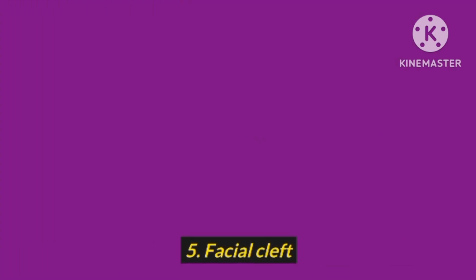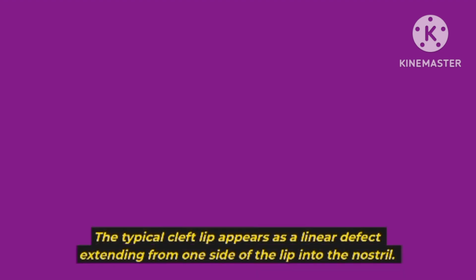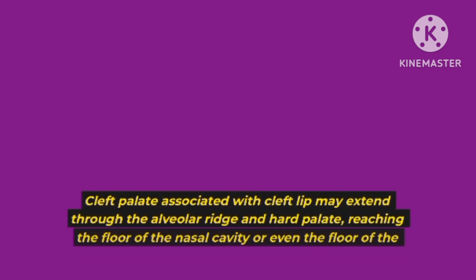Number 5, facial cleft. Ultrasound diagnosis: the typical cleft lip appears as a linear defect extending from one side of the lip into the nostril. Cleft palate associated with cleft lip may extend through the alveolar ridge and hard palate, reaching the floor of the nasal cavity or even the floor of the orbit.